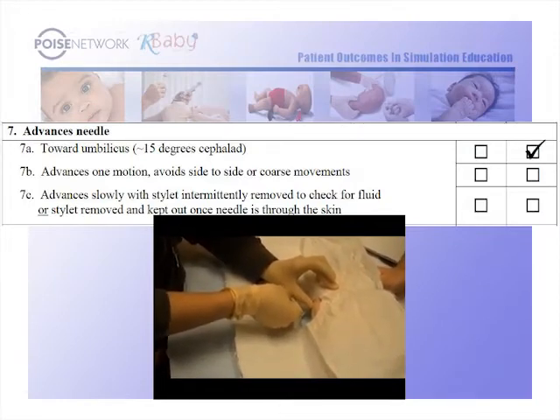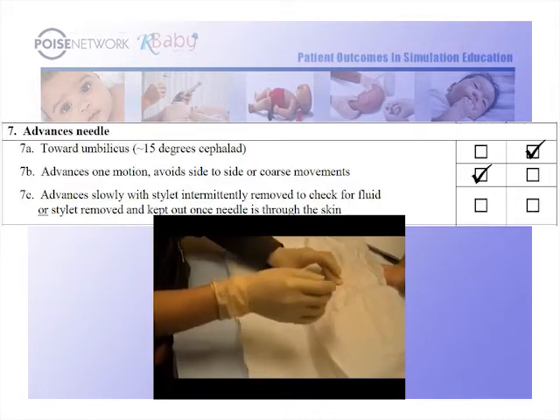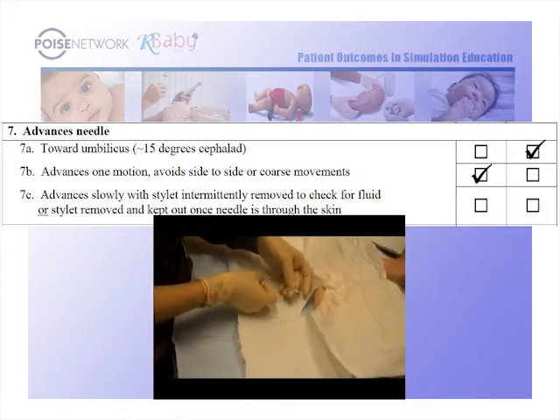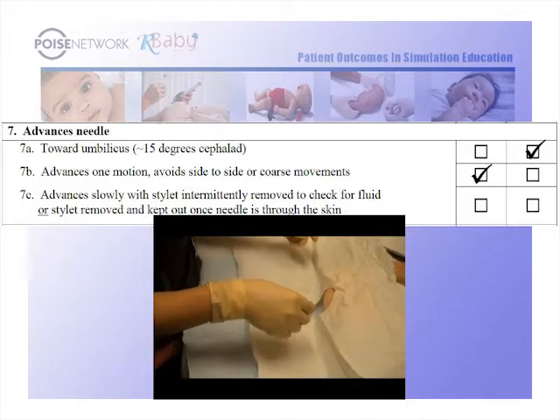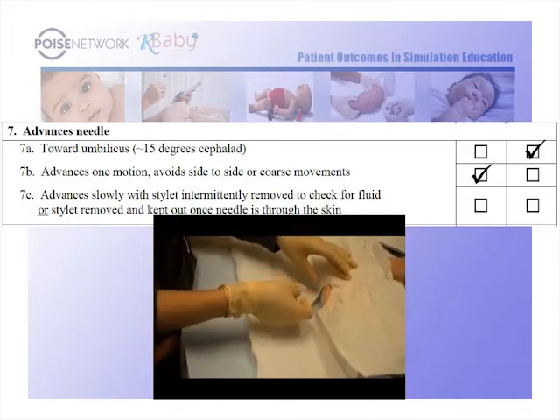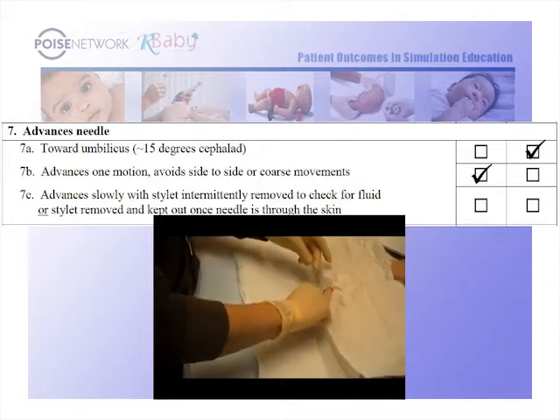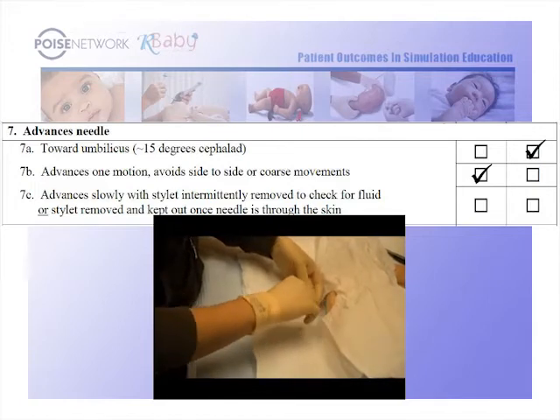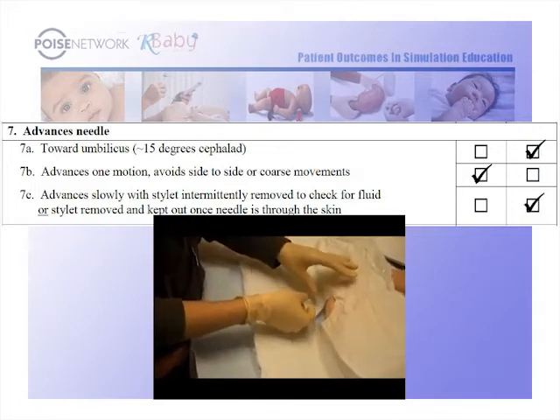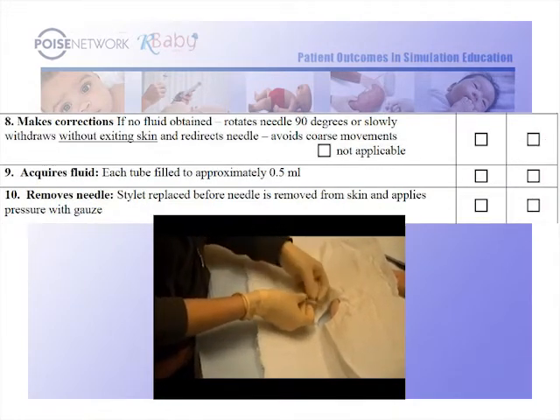Now nice and smooth, nice and easy. There. Alright, you can take the stylet out and see if you've gone in far enough. You should get a good rush of fluid. Okay. Maybe just advance it. Put the needle back in? You could do it either way, whatever you feel more comfortable. And just advance it slightly. A little bit? And keep checking.